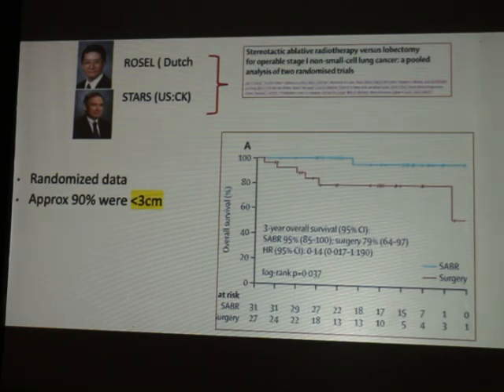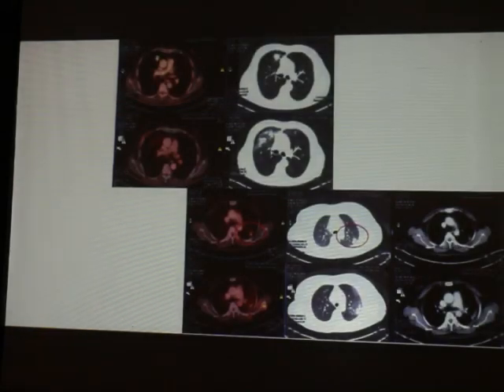There is no debate about inoperable tumors, it is radiosurgery. There is no debate when you cannot do a biopsy, it is radiosurgery. But what about the operable? In case of operable, there is an equipoise between radiosurgery and surgery in smaller lung tumors. That was the debate I had with Dr. Rama Mohan from Manchester.